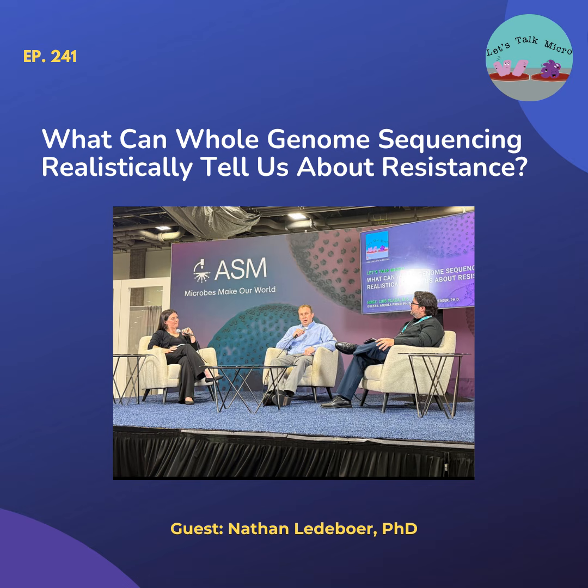And oh, by the way, we also have the challenge in mycobacteriology where the phenotypic approaches that we use, in some cases, we have commercial systems that are either on permanent back order or being removed from the market altogether. So I think there will be some market forces that are going to push us really to doing it more in TB. So I think it's actually going to be a routine process, especially in the US and Europe, that TB susceptibility testing will be a genetic-based approach.